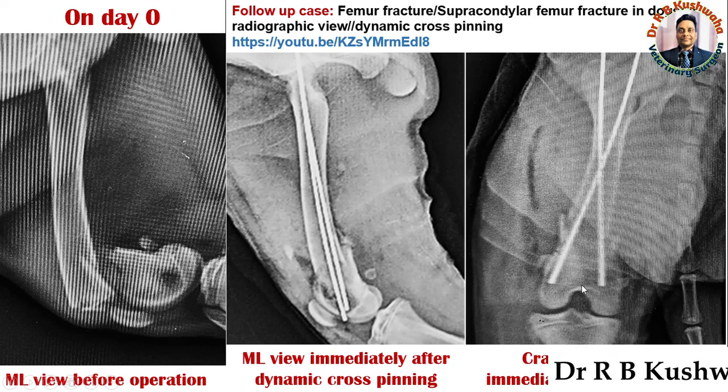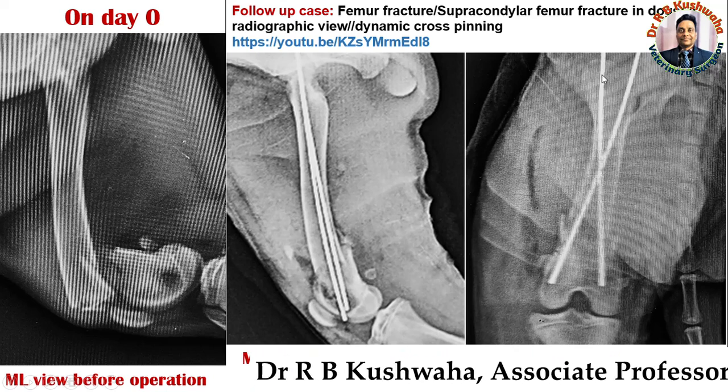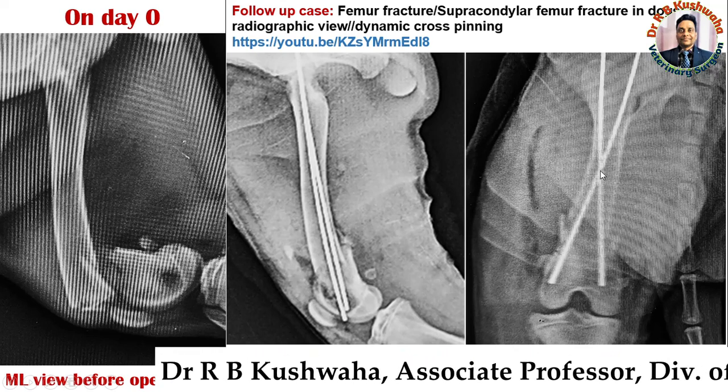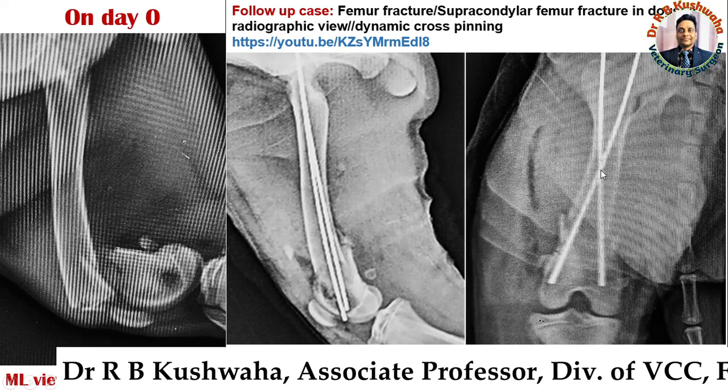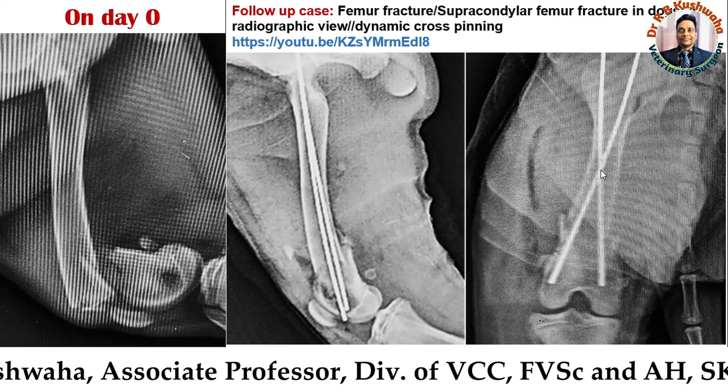You could see how beautifully the crossing has occurred. This crossing occurred at the mid-diaphysis, which is the desired location.